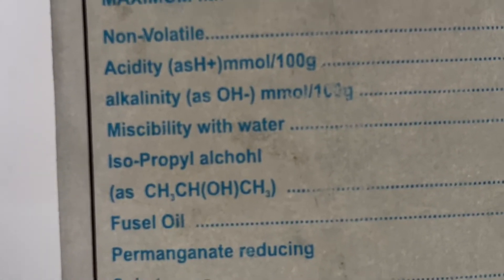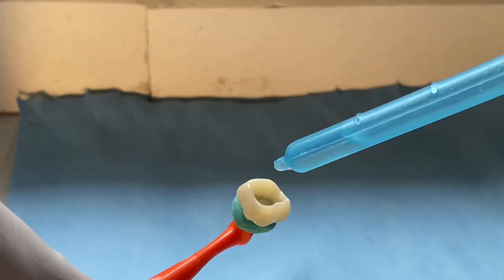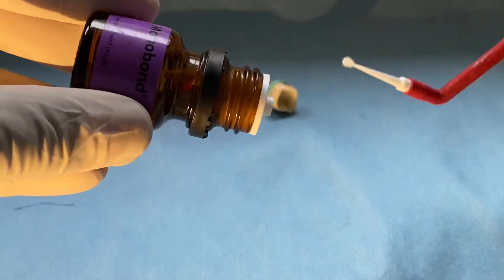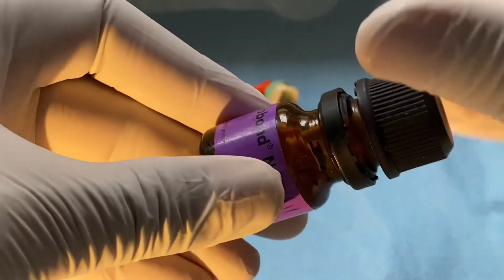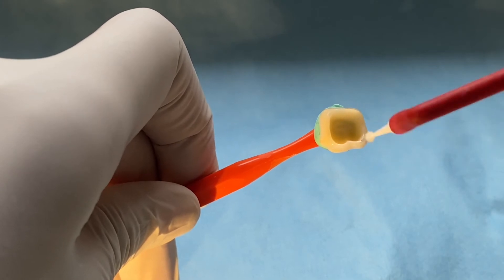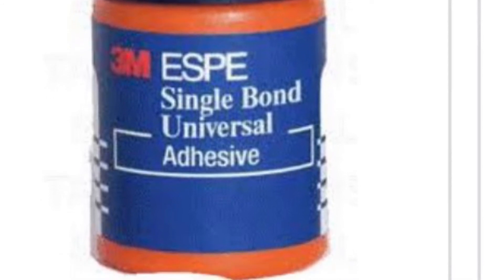Use one or two drops of isopropyl alcohol for cleaning and proper drying. This is a very important step: apply zirconia primer containing MDP and agitate it properly over the internal surface of the zirconia crown, then let it dry.